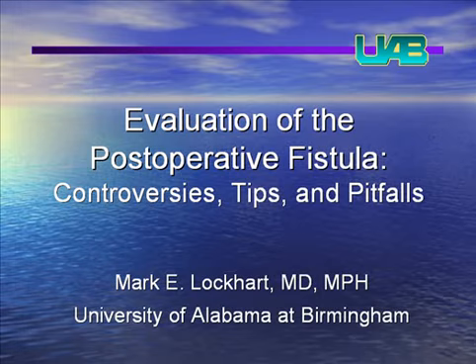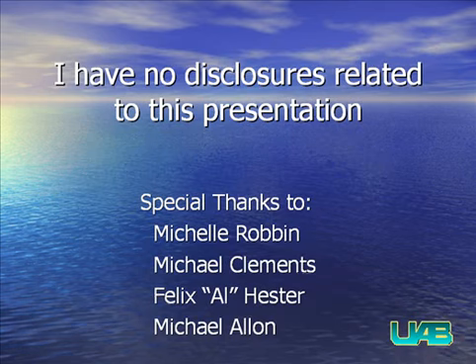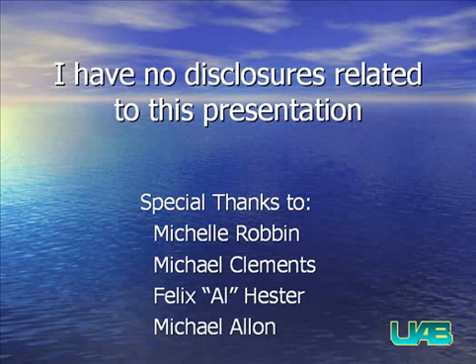Welcome. For the next 30 minutes, we'll be discussing the evaluation of the postoperative hemodialysis fistula. We'll discuss some of the controversies, certain tips for enhancing the examination, and potential pitfalls to evaluate for. I have no disclosures related to this presentation, and I'd like to thank my co-investigators as listed below.